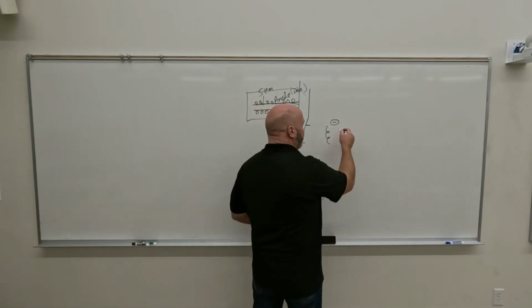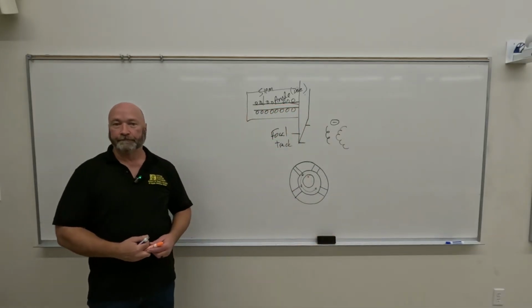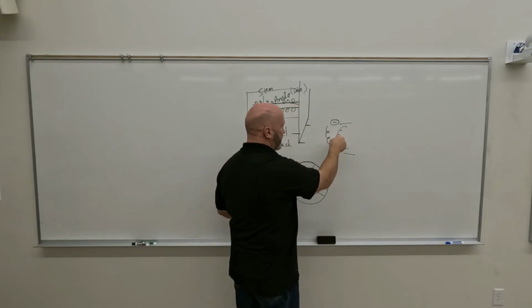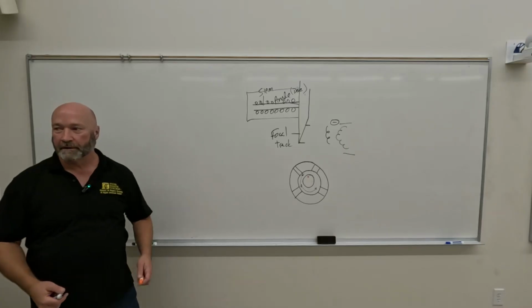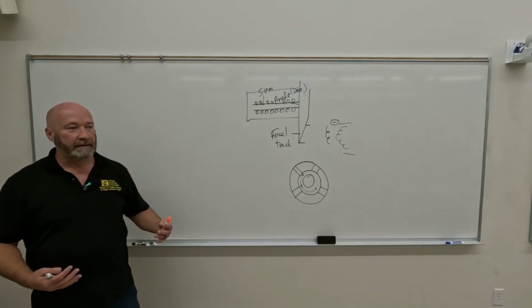Do you think that a filament that gets hot and does this might have an effect on sharpness or recorded detail? If the filament, or the focusing cup, only comes to here, then what's going on with the space charge out here? Right, now you hit it with a kVp, where are those electrons going to go? All over, right? Not good for your sharpness or recorded detail.